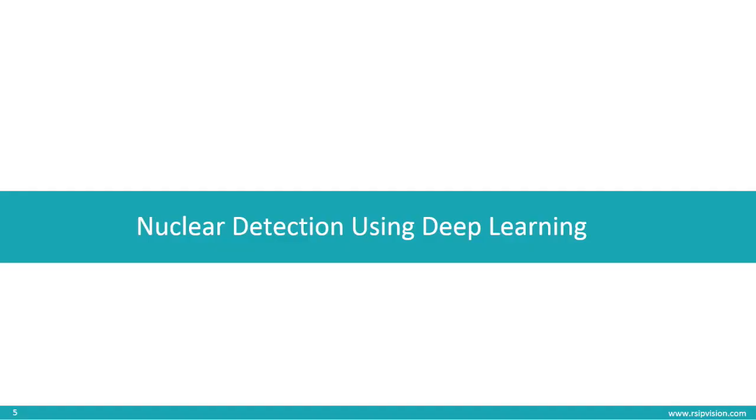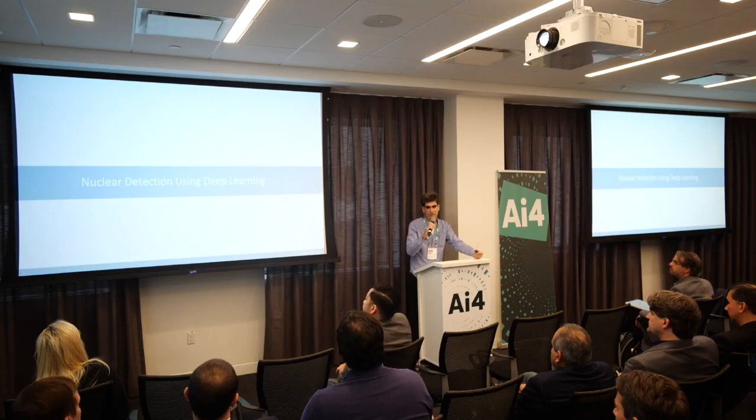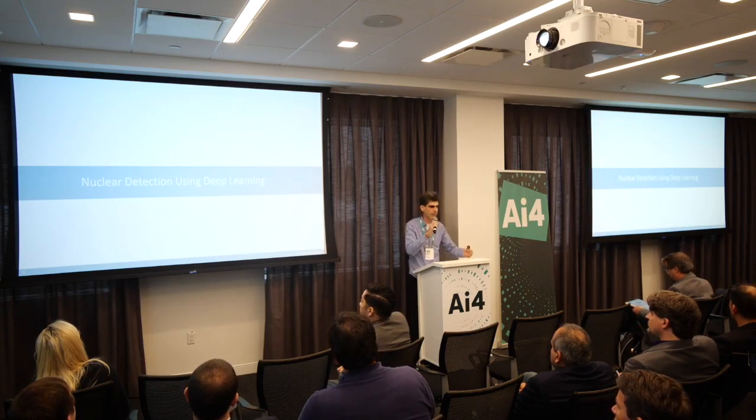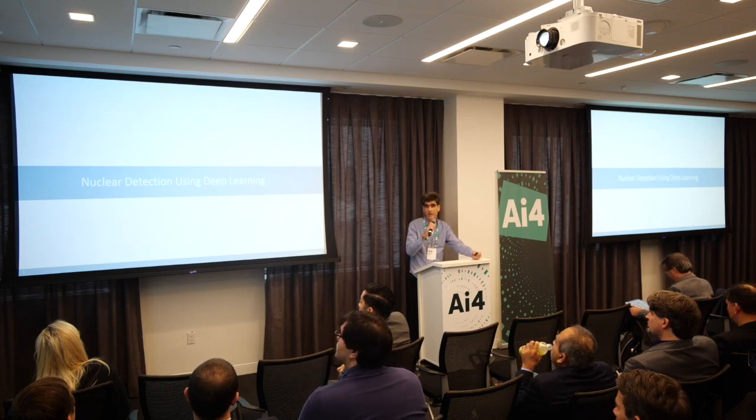Okay, so as I said before, nuclei detection is a critical step in getting an accurate analysis of these images. Of course, there are many tools that have been around for many years using various classical image processing methods. Some of these tools are very well entrenched in the market, and you need to tweak many parameters, many thresholds. People are used to having this kind of control over their system. Some people might prefer to use this kind of system.